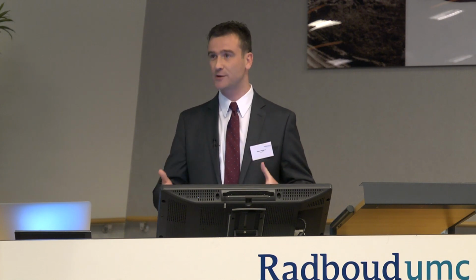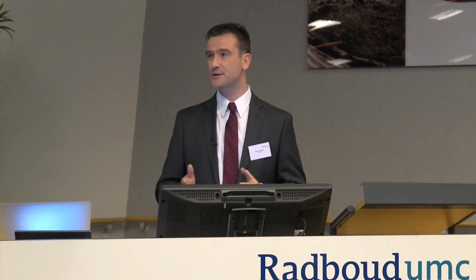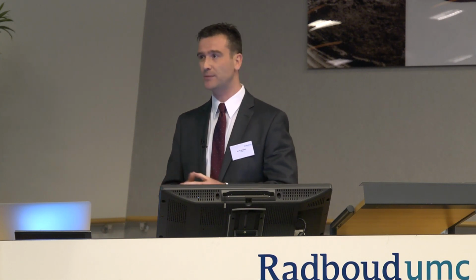They took the valve off, added some dead space to stimulate drive, and then coached the patients to do a second MIP. And what they showed was that if your initial respiratory drive measured by the airway occlusion pressure was high enough, there was no significant difference between the naive or uncoached MIP versus the coached MIP. So what this suggests is that in patients who aren't interactive, who are delirious or non-cooperative, by adding some dead space to achieve adequate respiratory drive, you can simply put the one-way valve on the end of the endotracheal tube and get a reasonably valid measurement of maximal inspiratory pressure.